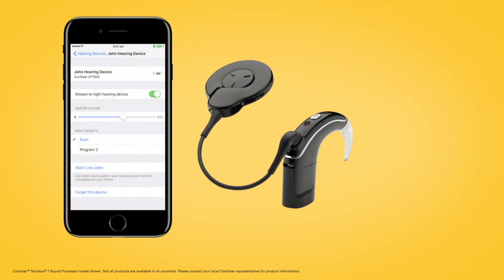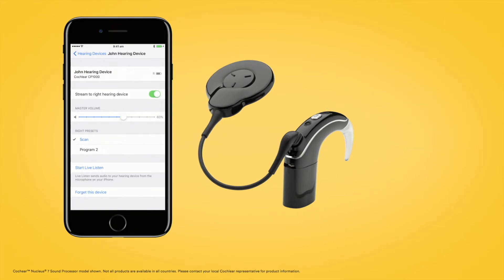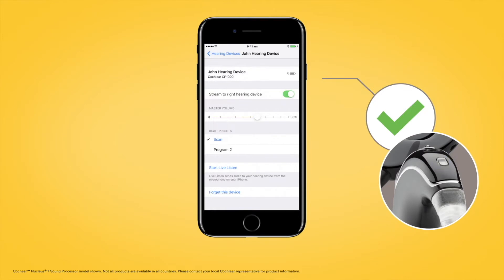You will hear six beeps to indicate that pairing has started. The sound processor light will flash blue for four seconds. The pairing will be finished when you hear a ripple tone and the sound processor light flashes blue for another four seconds.